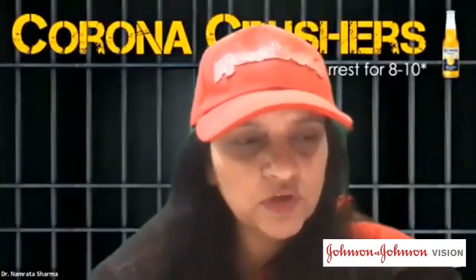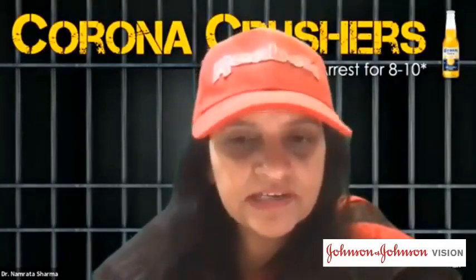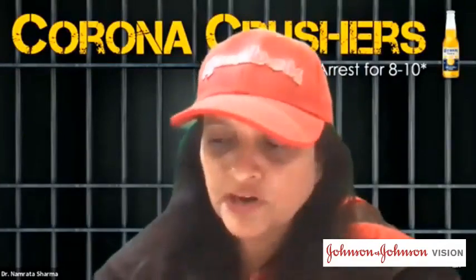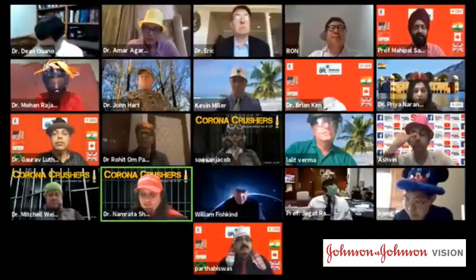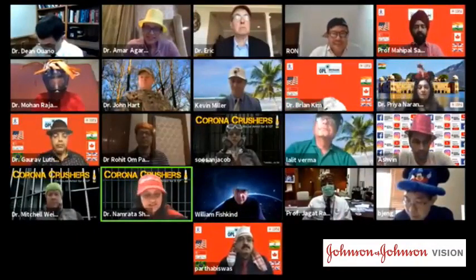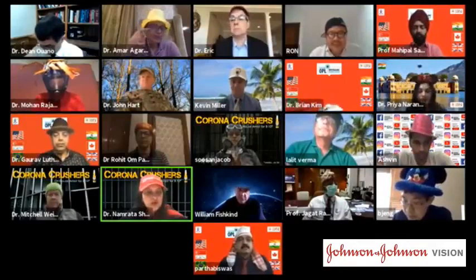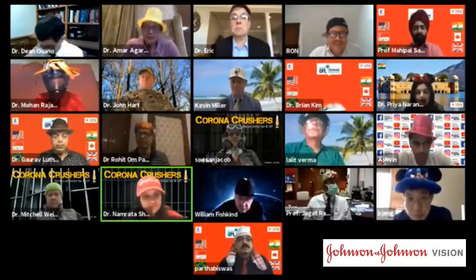There was one question which is for Dr. Lalit Verma. Since he's a retina surgeon, everything from the retina, we've taken into cornea, whether it's endo-illuminator for phaco or C3F8 or air for the tamponade that you use, or intravitreal scissors or micro scissors or micro forceps. How do you feel about it? Have you been able to do the other way around?